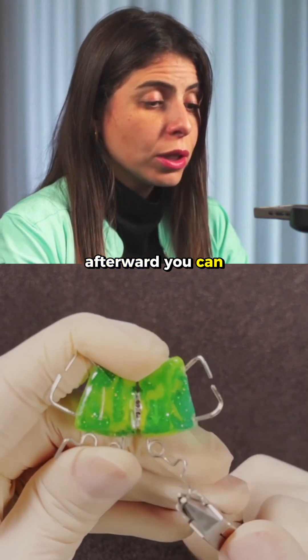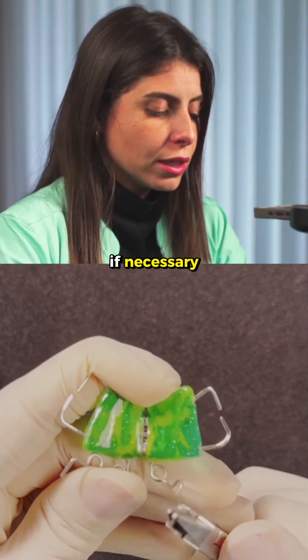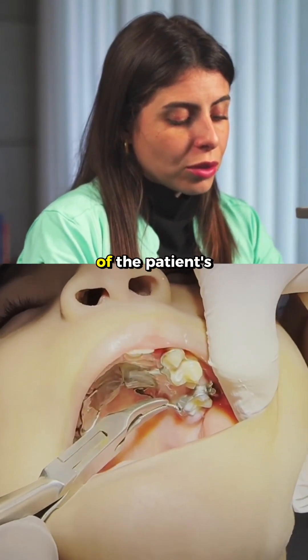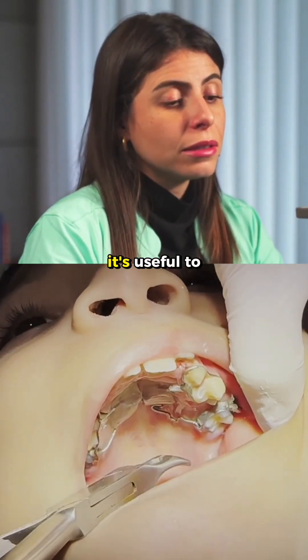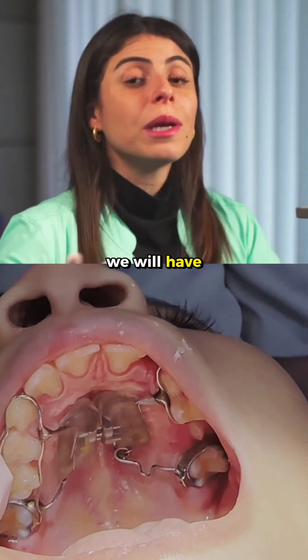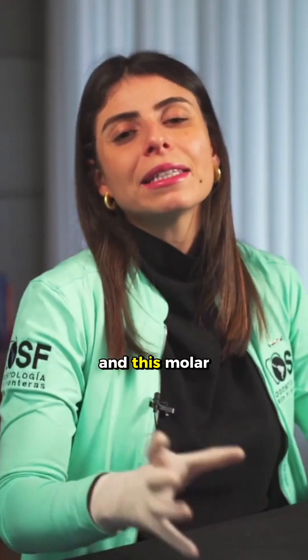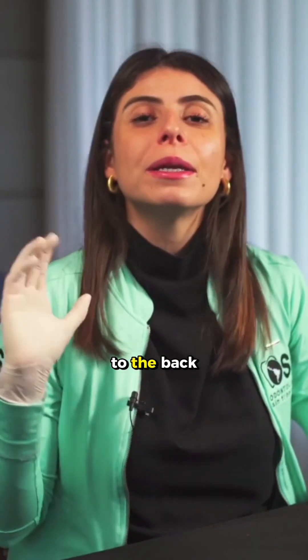Afterward, you can measure the force and even reduce the activation if necessary. During manipulation in the patient's mouth, it's useful to use the Wingard pliers. Throughout the month, we will have this active force because it's a TMA spring, and the molar will gradually move to the back.